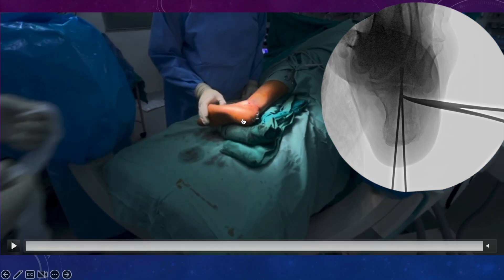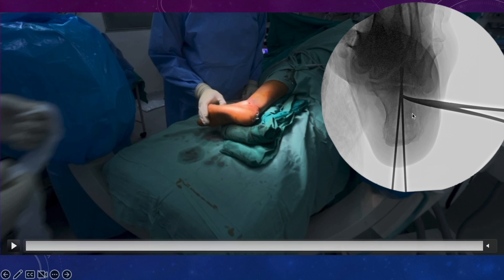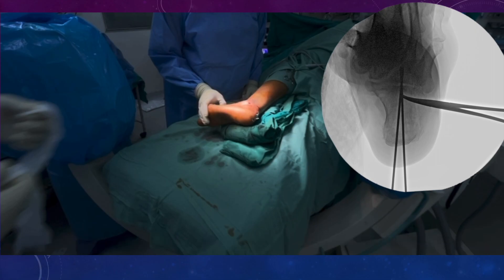The assistant is dorsiflexing the ankle, and you see the area of the beam here — it is not being hindered by any object, the surgeon, or any toes, which usually block the axial view. We are getting a perfect axial view without being hindered by the toes. We are able to see the posterior facet and the sustentaculum tali as well, which guides our reduction — whether it is going into valgus or varus.